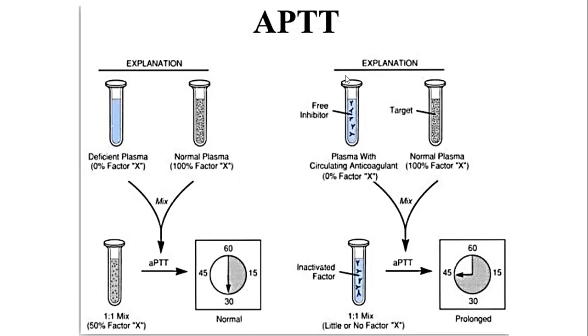Right? So gintest na ni siya beforehand, and ang nagwa ang iya APTT is prolonged. So we try to make a guess. Base may inhibitor ang samples ng pasyente. Base may ara siya inhibitor for the clotting factor 10. And that's the reason why prolong ang APTT niya kaina.